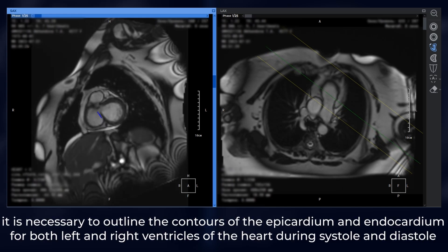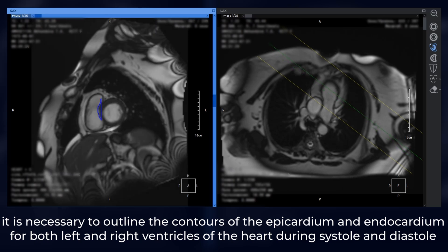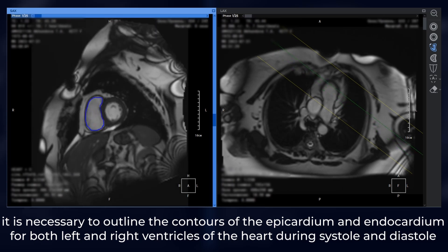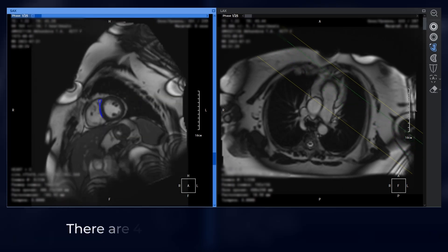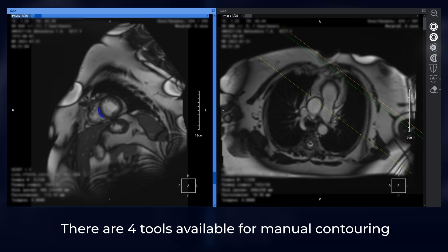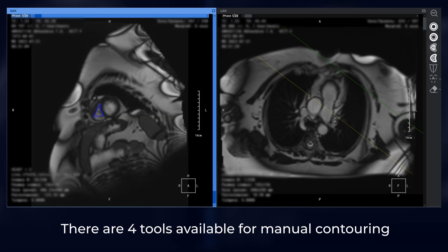it is necessary to outline the contours of the epicardium and endocardium for both left and right ventricles of the heart during systole and diastole. There are four tools available for manual contouring.